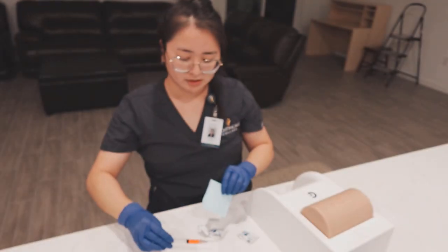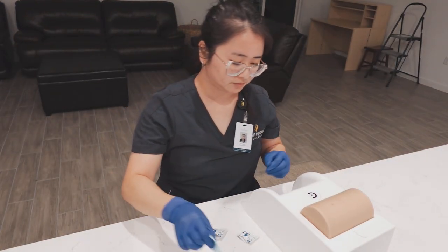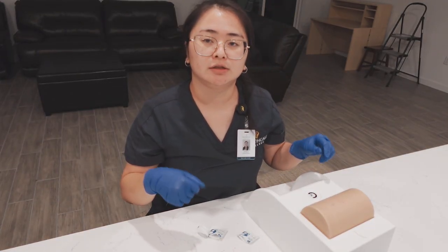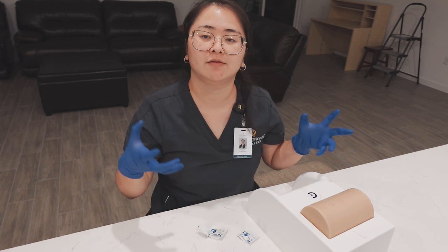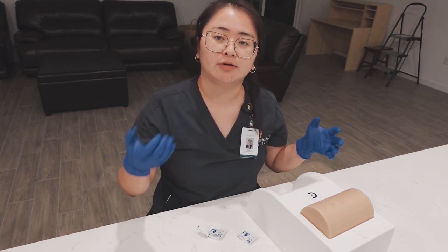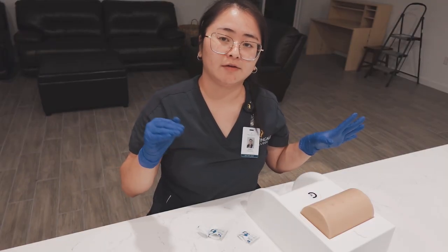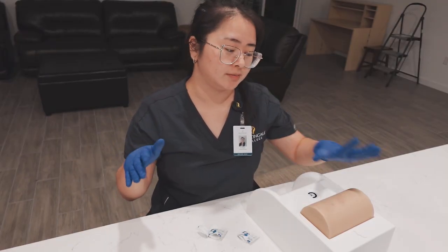All right. Now we're going to leave this here. And there are 3 locations we can do the injection. It could be the deltoid, the vastus lateralis, but today we're doing the ventrogluteus for Mr. Smith.